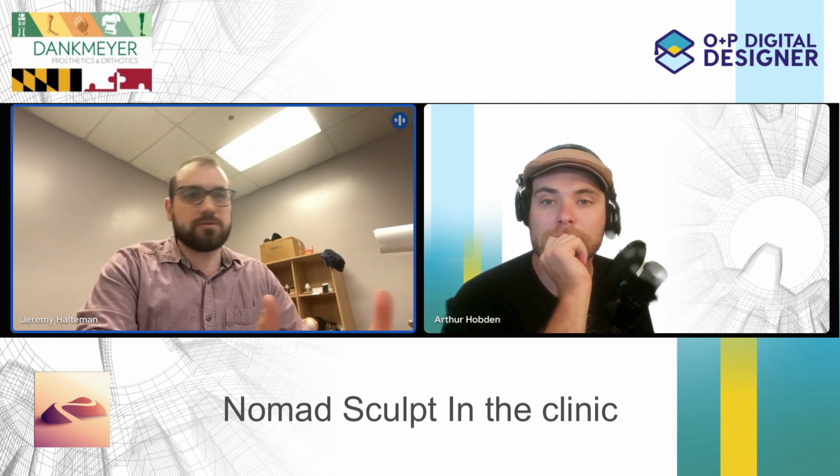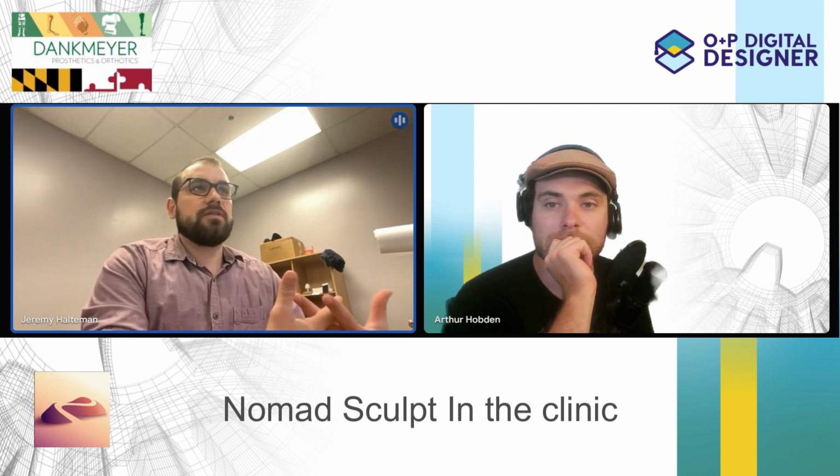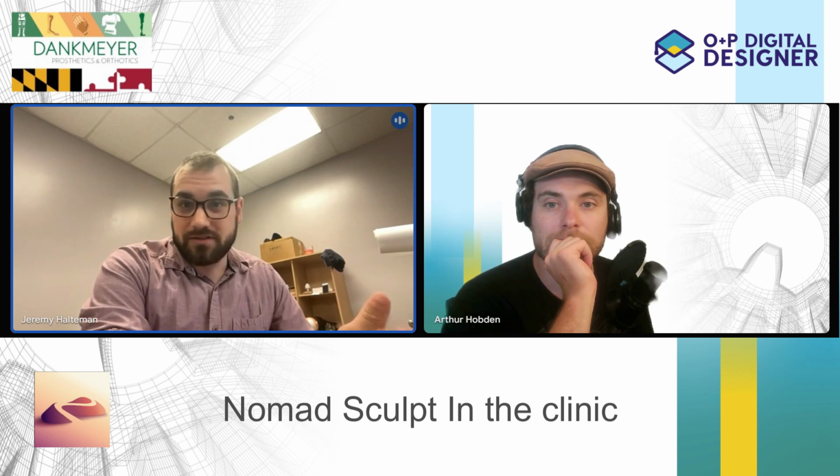It's a good question. I like the freedom that working in non-O&P specific programs brings, right? Mm-hmm. And you can make the same argument for Meshmixer and Fusion, all those things, it all goes hand in hand. There are some things that O&P software does really well. Typically that's measurements. Yeah. O&P software usually does a better job of gleaning measurements from your models.